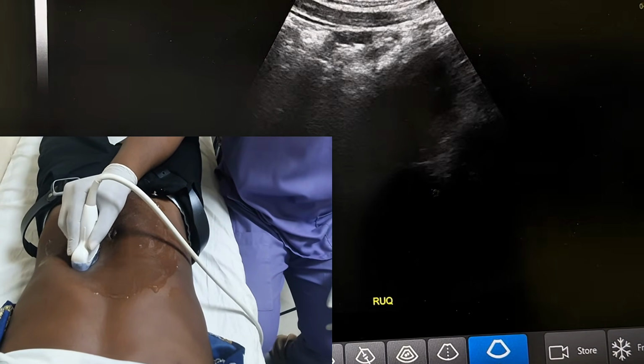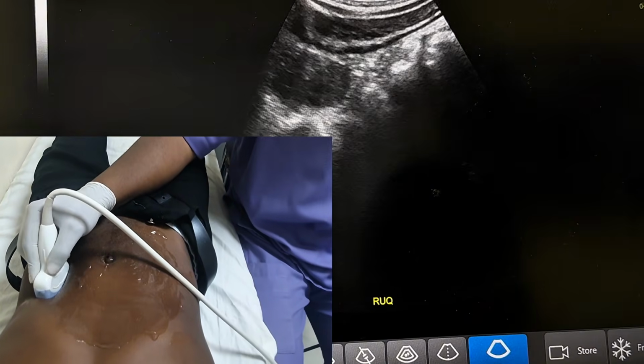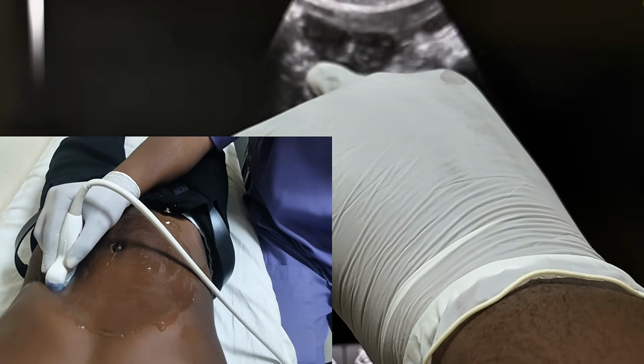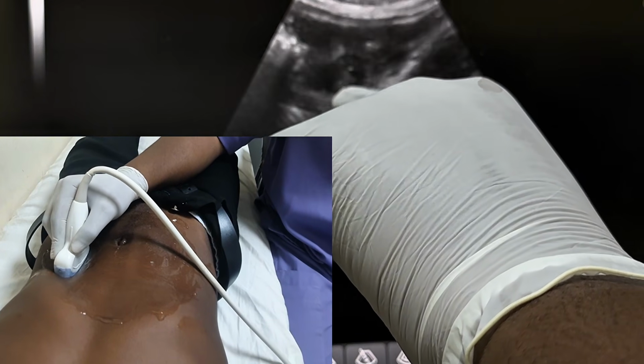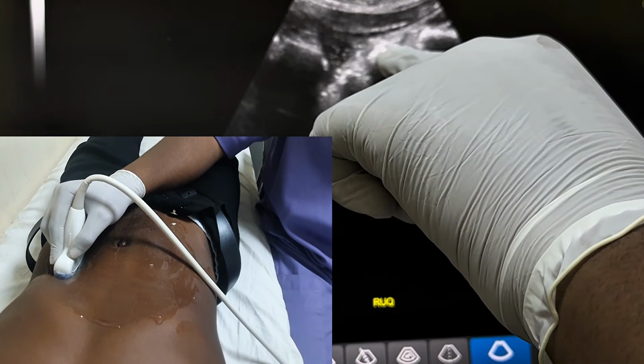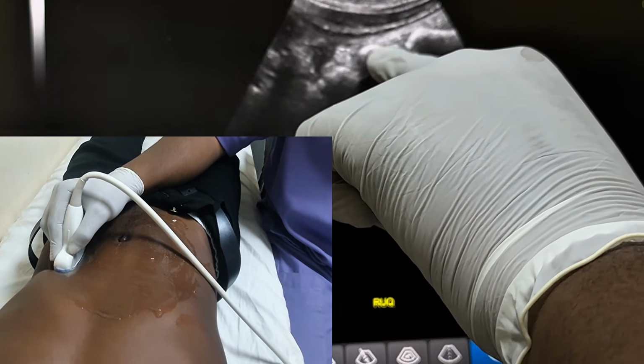I'm beginning to lose it a little bit. Okay, so it came down like this, came down like this, and then went sideways. So this is it. This is a continuation here.